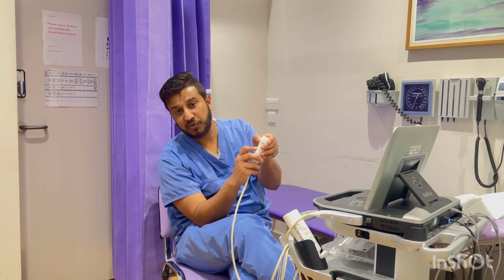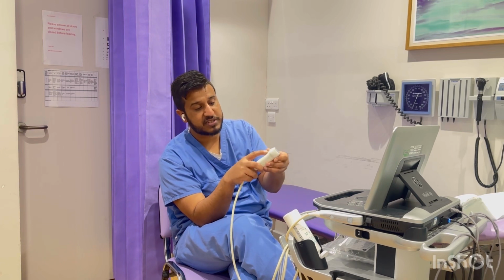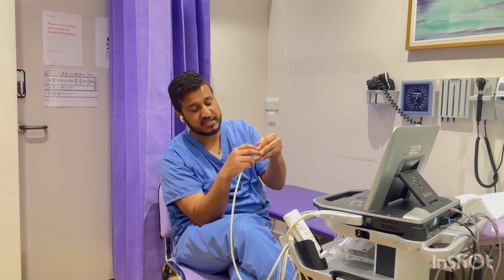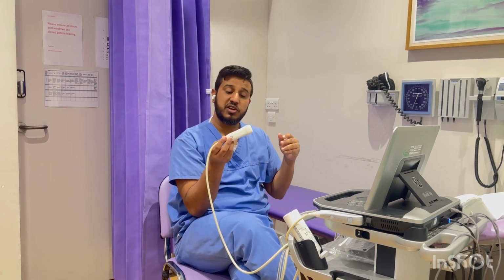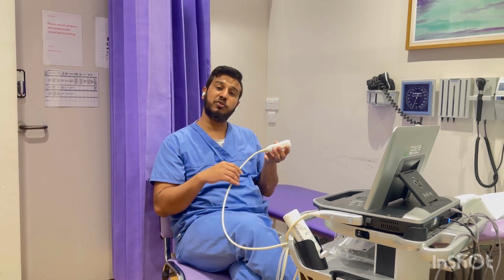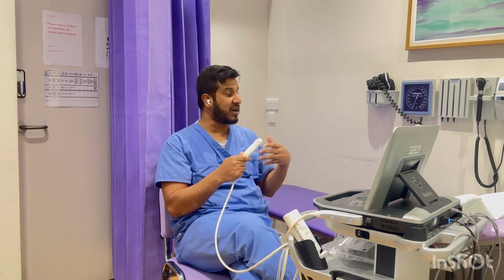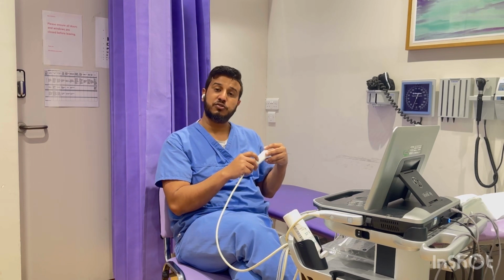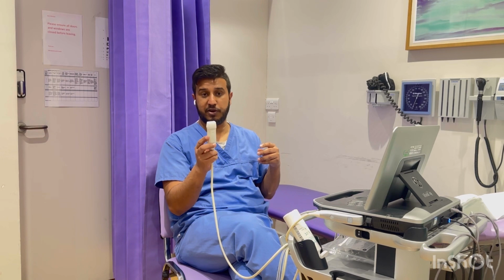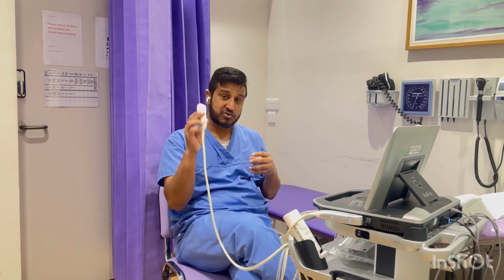Some probes do have a light here, this one doesn't have it, but you can hold it. So this is the marker of the probe, this is the base of the probe where you put on the patient's chest, and this is the tail of the probe. You need to know all these things, because once you are going to take images, you need to move these areas, or you need to do different maneuvers to get better images, or to change your angle. So you need to know where the marker of your probe is, and where you need to keep the marker of your probe.